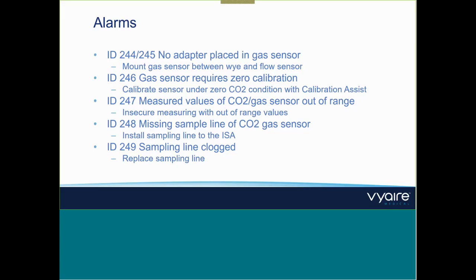The advantage of the transcutaneous CO2 is mainly that it's non-invasive, because whatever we do on side stream or on mainstream, when there is leakage, we can't guarantee that the CO2 measurement will be perfect, because we don't have the full information of the exhaled air of the patient. This is the big advantage of the transcutaneous measurement, because it's not relying on air or leakage, because it's measuring in a quite complicated process the CO2 level of the skin. The disadvantage is that it's mainly a standalone device, not the cheapest one. And also there can be lots of things when the patient is sweating or has fever. So this can also impair the measurement of a transcutaneous CO2.